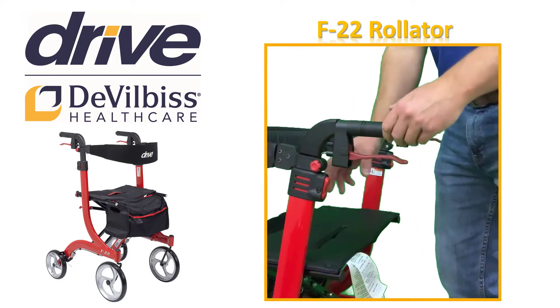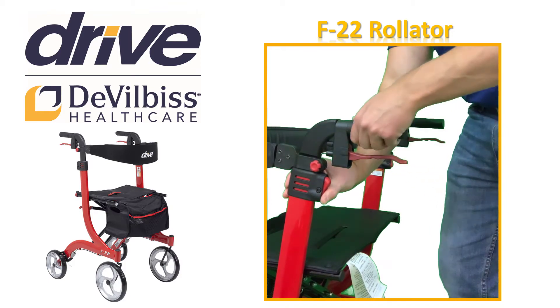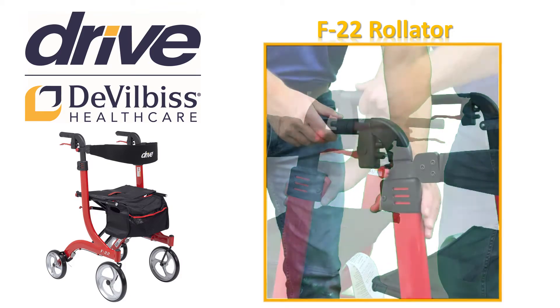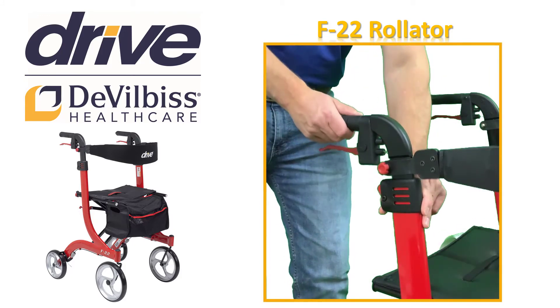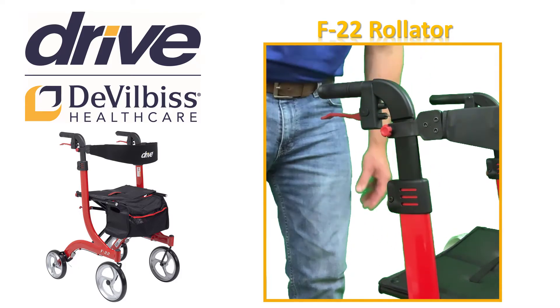First up, the handle height adjustments. Press the red release buttons for hand grips and pull the hand grip upwards at the same time. As the handle moves, release the button. This automatically locks in the next possible height. Repeat this process until the desired height is reached on both sides.